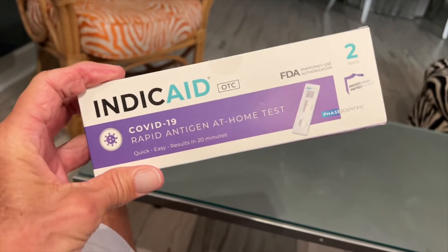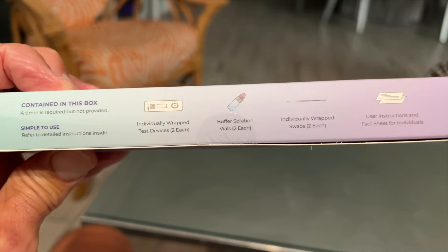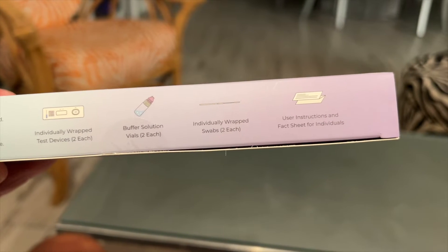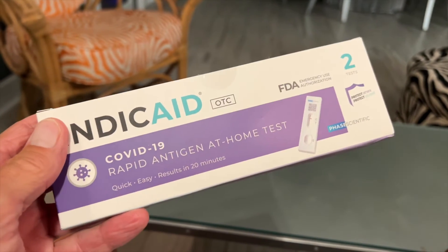I just got these in the mail and I've never used this one before, but apparently it comes with everything that you need contained in this box — individually wrapped test device, solution, the swabs, and the instructions on how to do it. So let's give it a shot and see how it works.